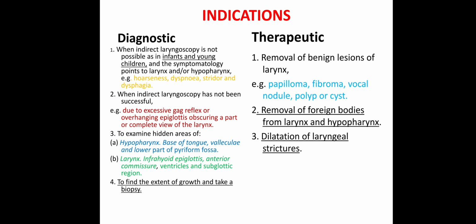Indications can be diagnostic or therapeutic. Diagnostic indications include when indirect laryngoscopy is not possible, as in infants and young children, and the symptomatology points to the larynx and hypopharynx, such as hoarseness, dyspnea, stridor, dysphagia.